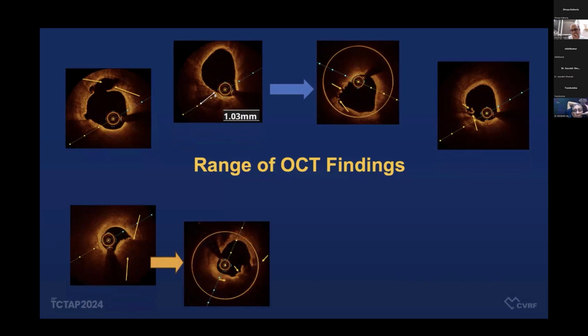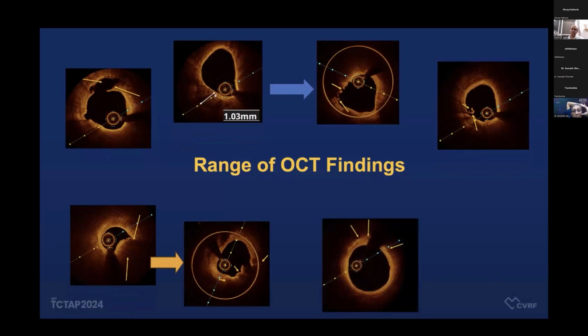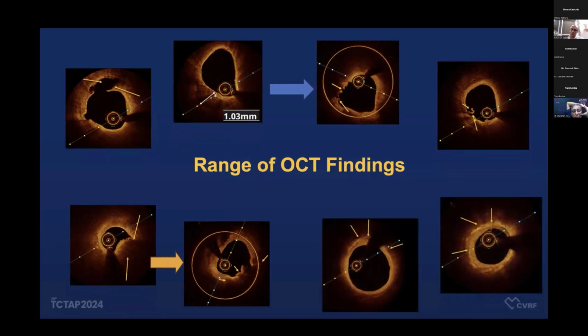But as you can see with the IVL, the nodule at the same place had sunken. So the stent delivery was easier, and there was some fibrofatty plaque, and there was some lipid crystal. So a range of OCT findings were there in this particular case, which led to a lot of teaching.